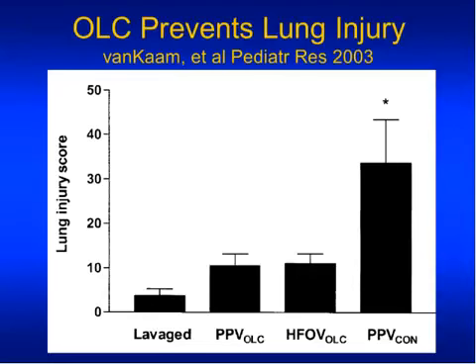So this suggests, and many other studies of a similar nature suggest, that it isn't really the high frequency itself, but rather the fact that we are routinely using the open lung strategy with it, and perhaps arguably in some babies, some of the sicker babies, it is easier to achieve lung volume recruitment with high frequency. But if we can achieve it with conventional ventilation, we probably have the same benefits. So it's the open lung strategy that's key.